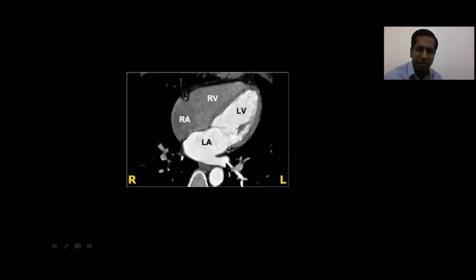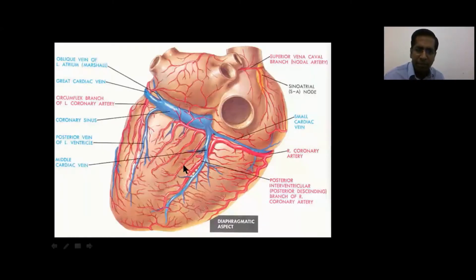The purpose of putting this is also to explore and see whether we can look at other kinds of images to build our understanding of anatomy as well as the imaging modality itself. I told you the coronary sinus was at the back. So when we tilt from an apical four-chamber view posteriorly, we get the coronary sinus.